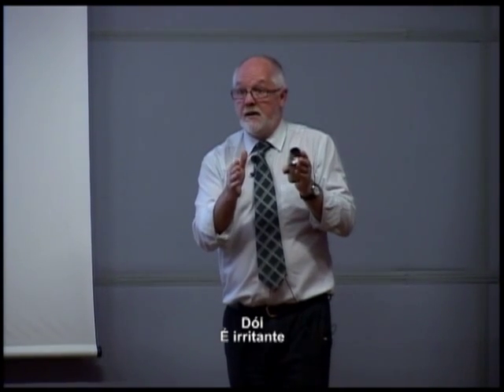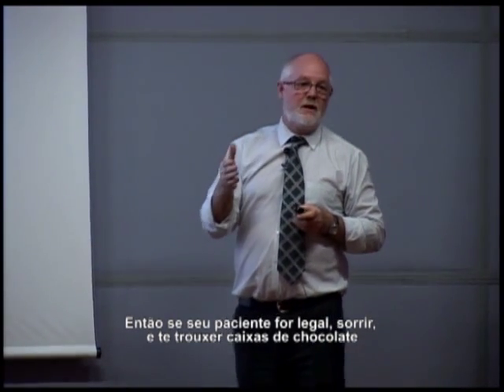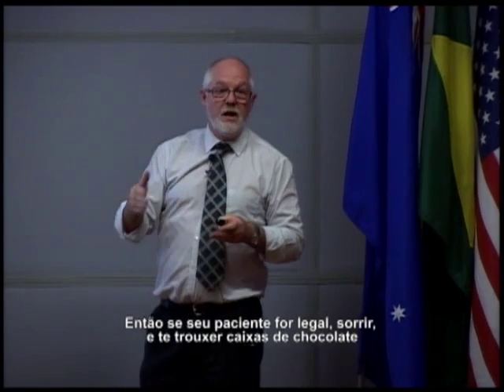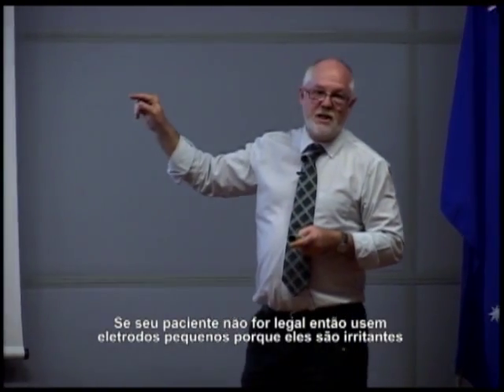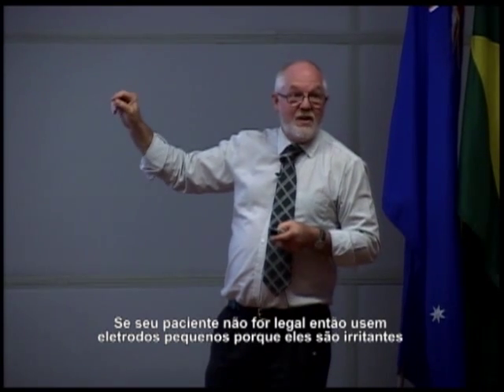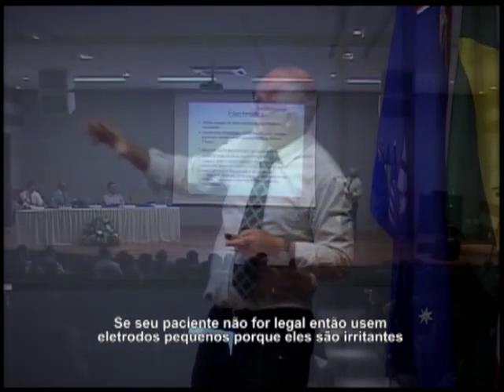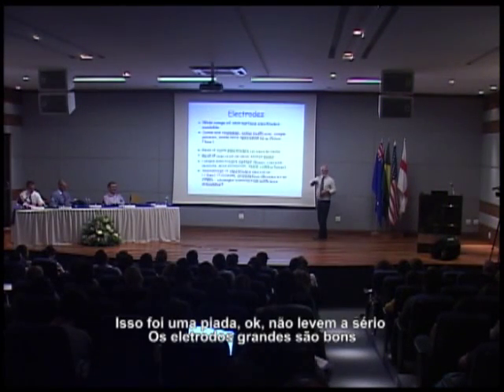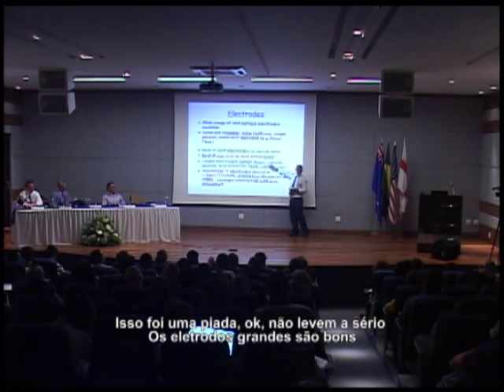It's irritating. So if your patient is nice and smiles and brings you boxes of chocolates, use a large electrode because it's kind. If your patient is not nice, then use small electrodes because it's irritating. All right? That's a joke. That's not serious. Okay? So large electrodes are good.